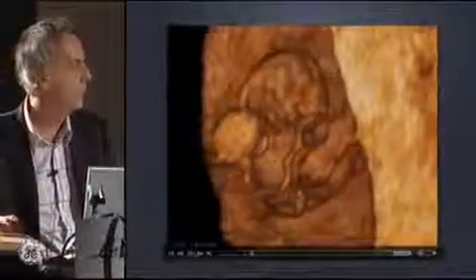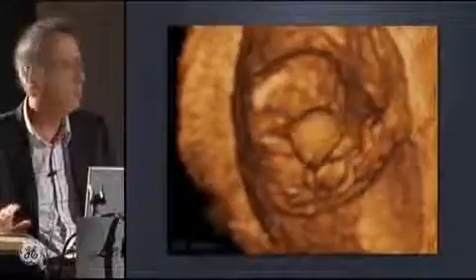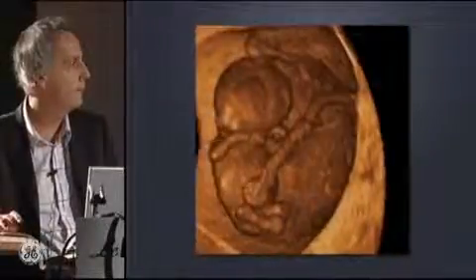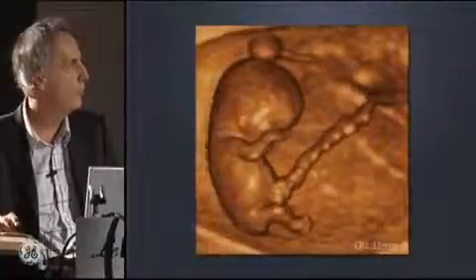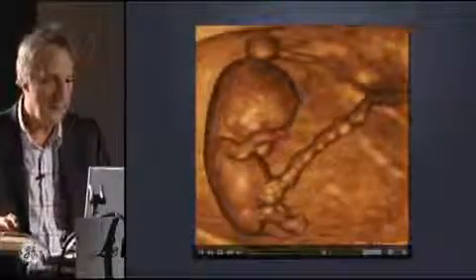Look at this. The size of the embryo is only 16 millimeter, made with this new probe. And another one at 10 weeks. It was 31 millimeter, and you can clearly see the midgut hernia with intestine inside.